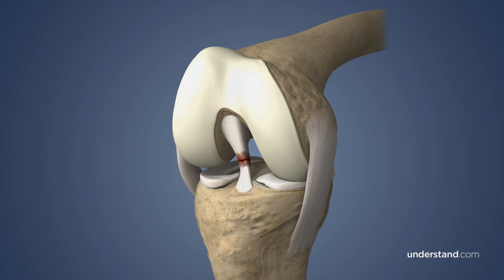First, your surgeon will remove the torn ACL and clean any debris from where the ligament was attached. Using a guide wire and a special surgical drill, your surgeon will create a bone tunnel in the femur and tibia where the graft will be anchored.